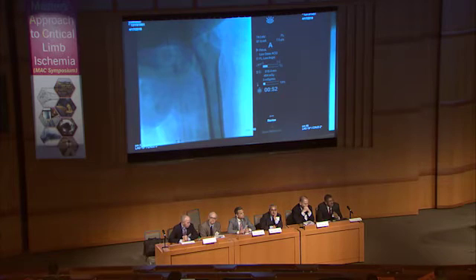Dr. Burkhardt, please. Going up here on the profunda. Okay. Please continue. It's a 5 balloon.